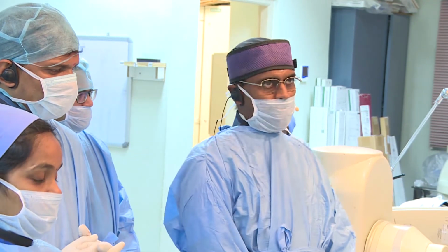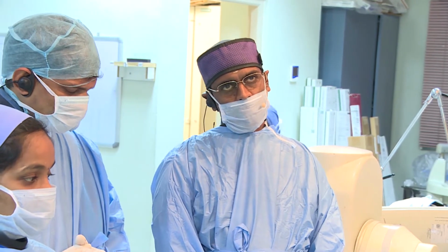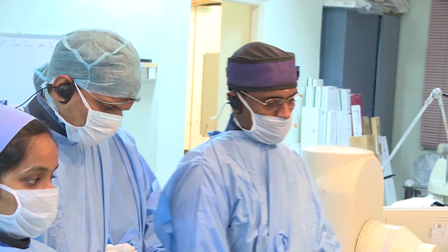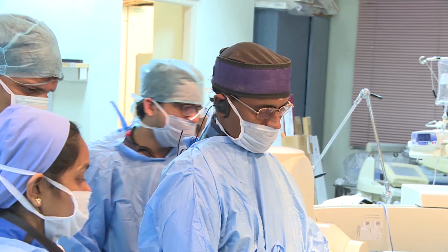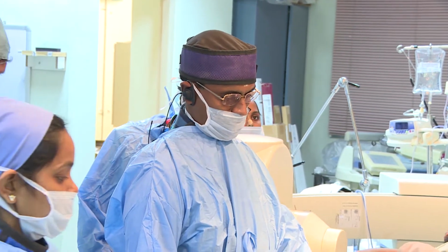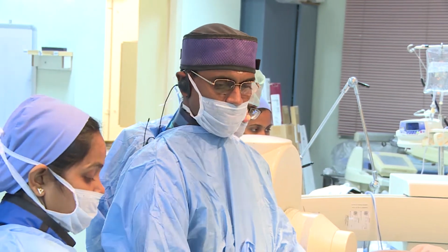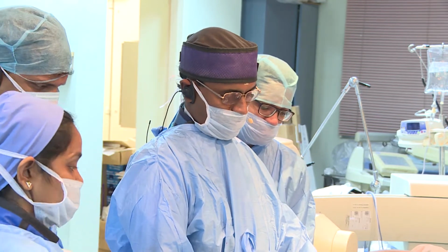It's sure. So final thing from you, Jesse. Based on this information, what would you do? Let's have you commit. Sure. So I would remeasure the saturations. I would probably perform acute vasodilator testing to see if the left-right flow increases under those settings. And then I would probably test occlude the PDA before committing to closure. Great. Dietmar?